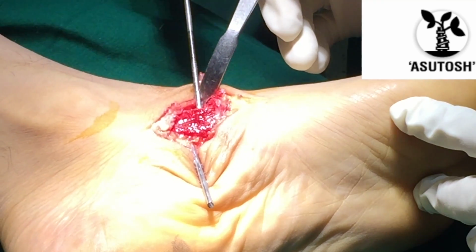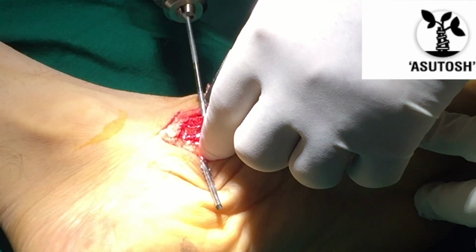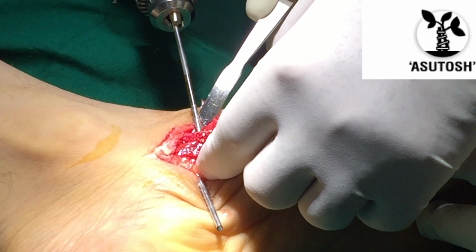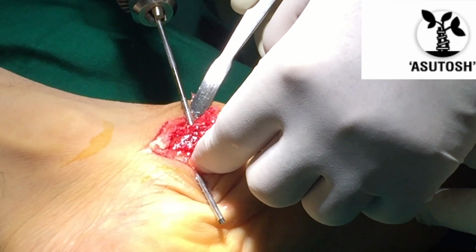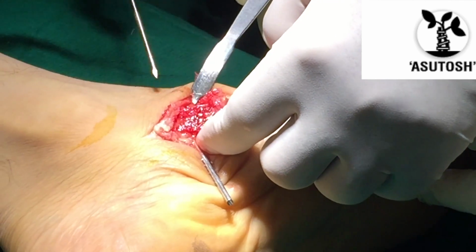We have to take precautions to prevent splintering of the navicular, because in that case we would land up in a very difficult situation. We must take our own time to drill these holes.